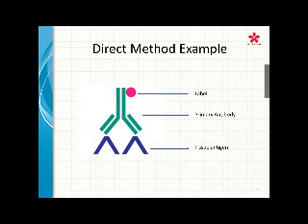So looking at the model, you can see at the bottom, it shows your tissue antigen, which is your patient tissue, your primary antibody, and your label. It is very simple. Your label is what's visualizing, so that you can actually see that reaction happening. There are not too many steps in between. And because the reaction is very minimal, the sensitivity is low due to the little signal amplification that's being provided by the process.